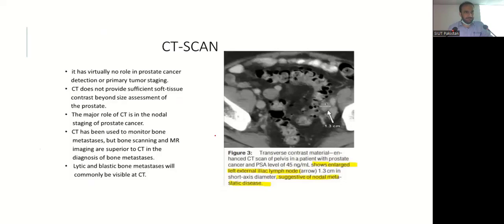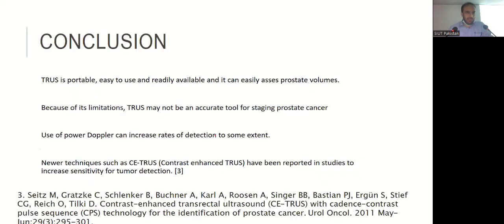Dr. Amit, we read about contrast-enhanced TRUS. Is it the same machine with which we do TRUS, and we inject that contrast, or is some hardware upgradation also required for this technique? The machine remains the same, only the microbubbles contrast is given, and the contrast uptake can be seen on the ultrasound, so the same ultrasound machine can be used. But for prostate elastography, updated software is required. For the microbubble technique, no upgradation of the machine is needed.